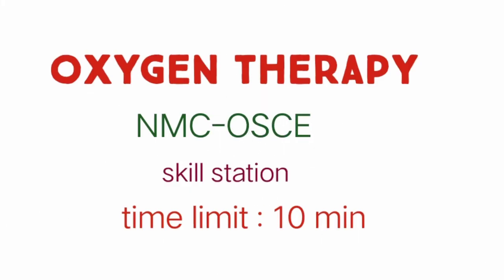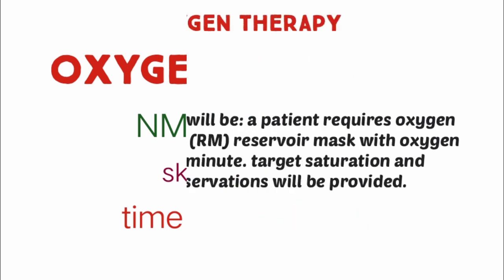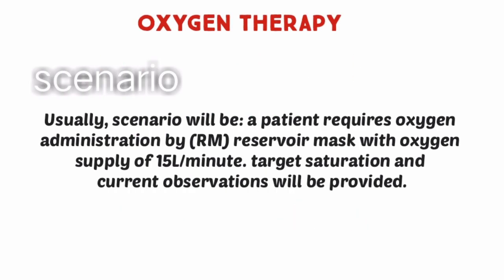Oxygen therapy, NMC OSCE skill station, time limit 10 minutes. Usually, the scenario will be a patient who requires oxygen administration by using a reservoir mask with oxygen supply of 15 liters per minute. Target saturation and current observations will be provided.